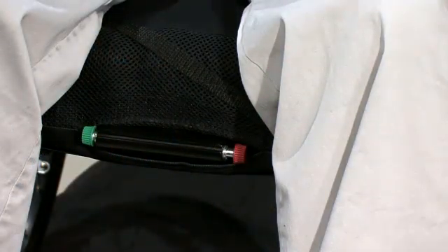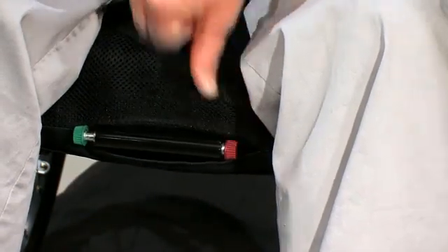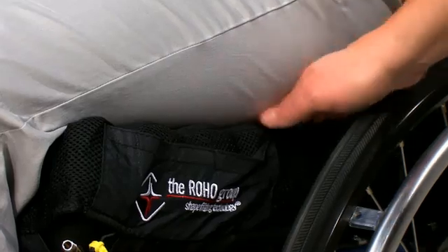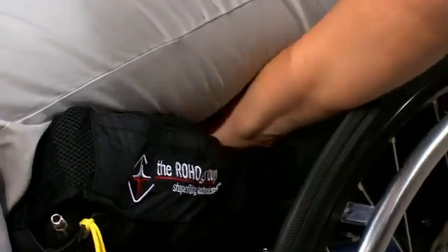Now position the individual on the cushion in their desired posture and have them maintain this position while air transfers through the ISOFlow memory control. Once the air transfer is complete, push the ISOFlow's red knob toward the left in the locked position. This will isolate the flow of the air and provide a more stable sitting position. You will need to recheck each compartment of the cushion to ensure proper inflation. The adjustment is now complete.